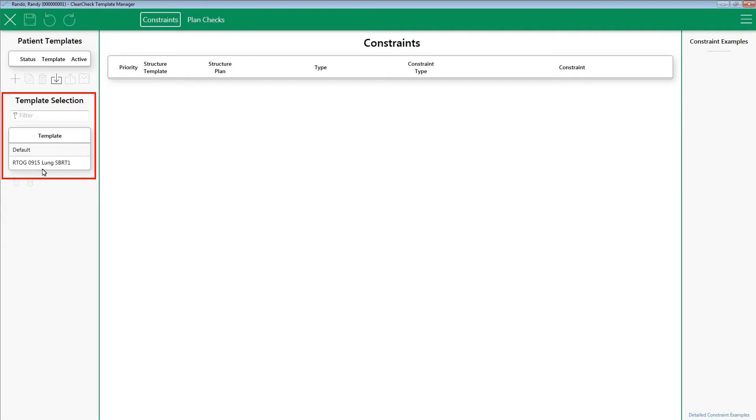Now everyone will have access to this constraint template. You may wish to export your constraints for various reasons, for example, backing up constraints, sharing constraints, etc. As with importing, you have two options for exporting out constraints.